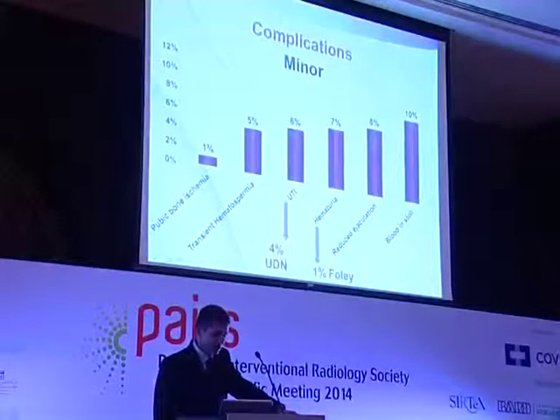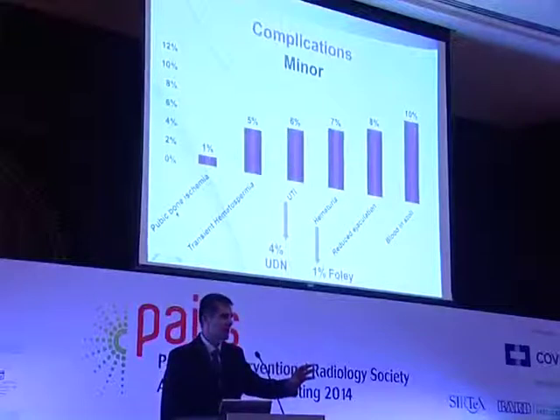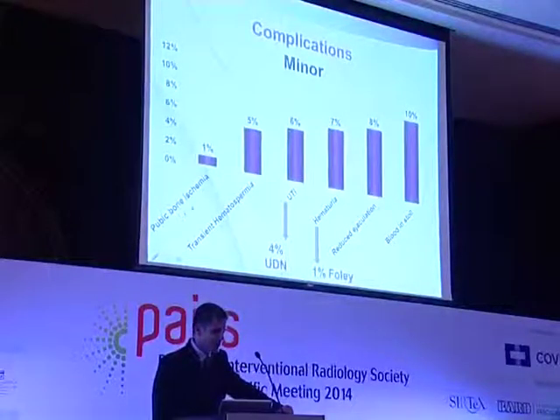Complications, very important. We got one patient with pubic bone ischemia, just incidental, seen on the MRI. Transient hematospermia, 5%.